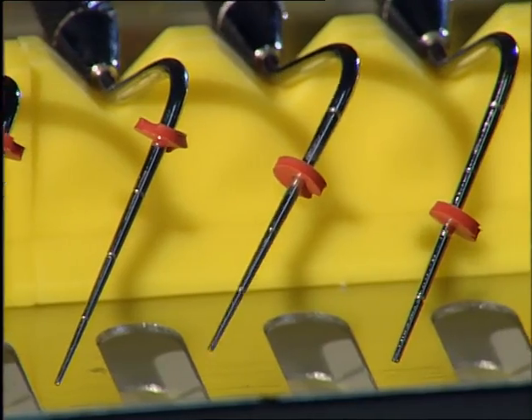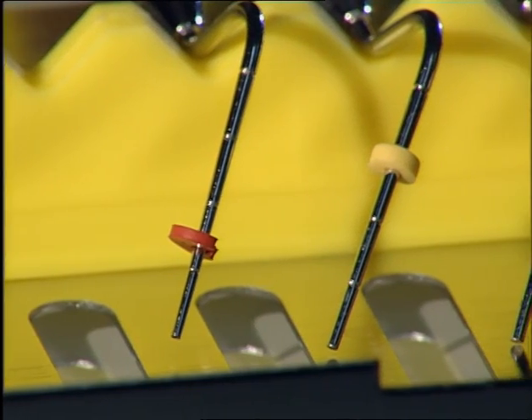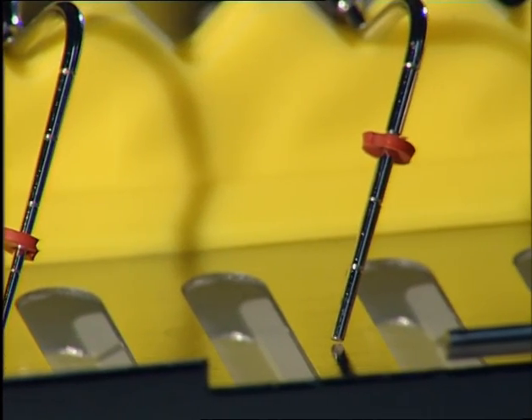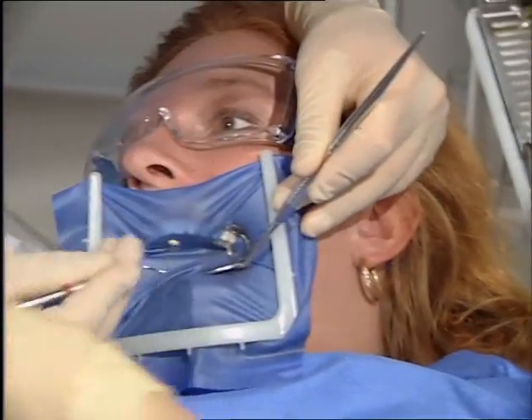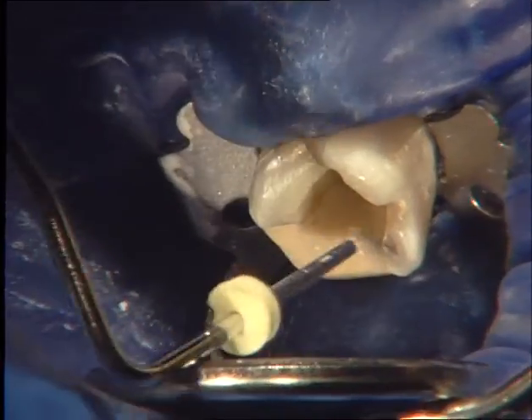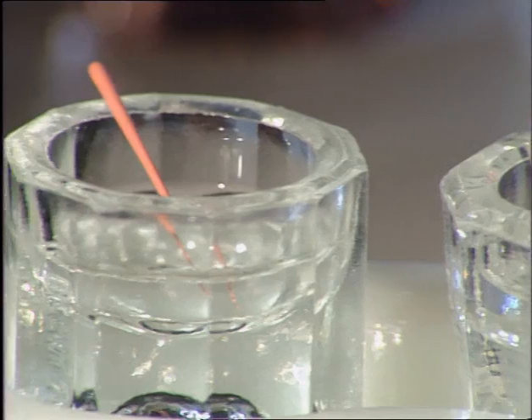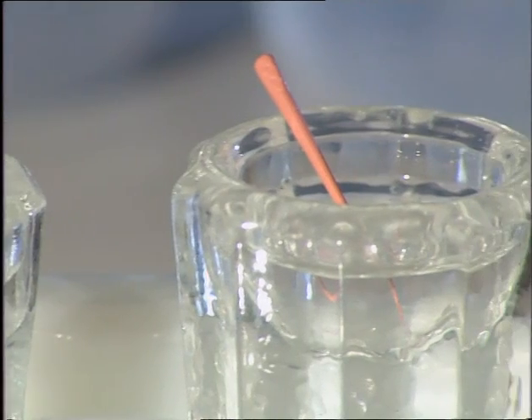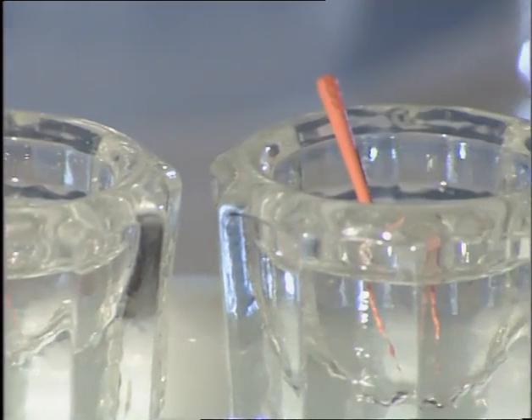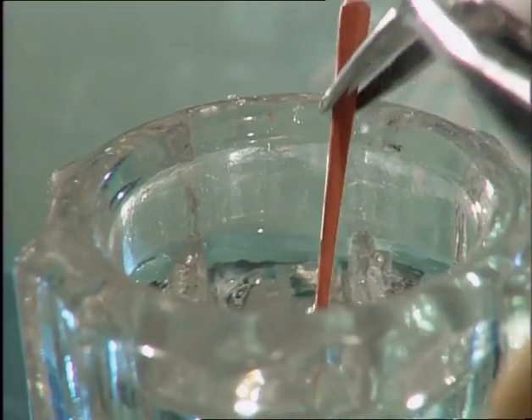The essence of the technique is to capture a maximum cushion of softened gutta percha and to compact it. Pluggers are selected whose diameter is just slightly less than that of the canal at any given level. 3 pluggers are used for any one root canal preparation. They are pre-fitted to the desired length. The largest diameter plugger must work passively, unimpeded by dentinal walls over a range of a few millimeters in the coronal 1/3. A smaller diameter plugger is chosen that can work effectively in the middle third, and a smallest plugger is selected that can work easily to within 5 to 7 millimeters from the canal terminus.